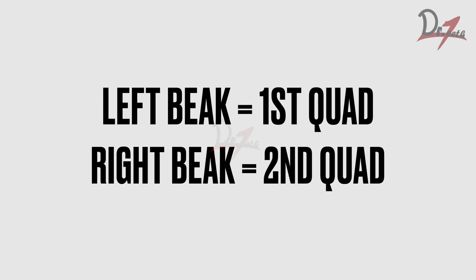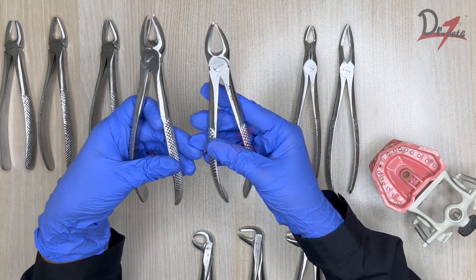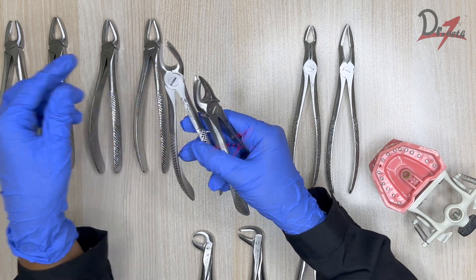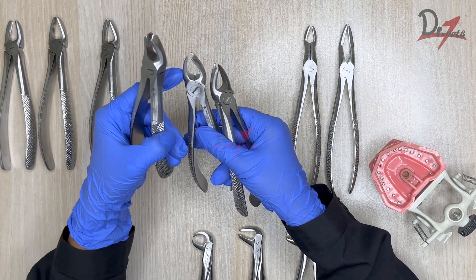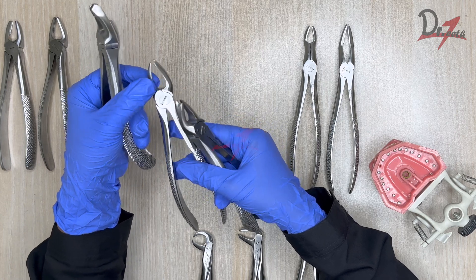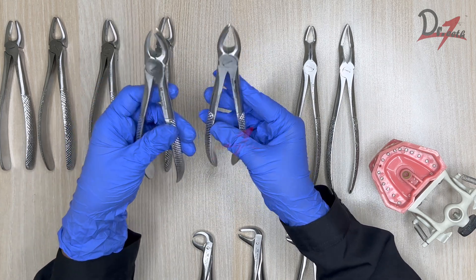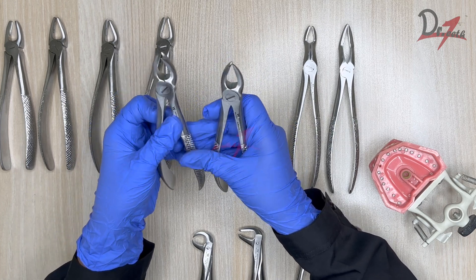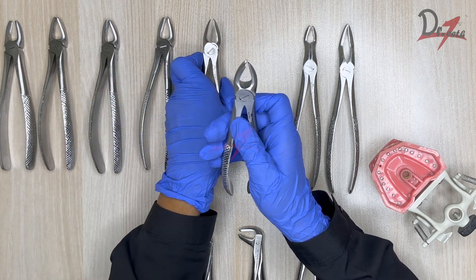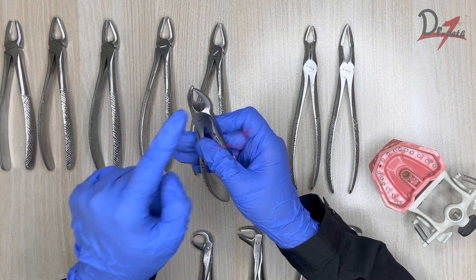These two forceps look very similar to the molar forcep, but these are the maxillary cow horn forceps. Comparing them, you'll notice there is more convexity, it is more pointed and very sharp — resembling a cow horn. So you can make out the difference between the maxillary molar and the cow horn forcep. We also have two types of cow horns: one will be engaged between the two buccal roots for the first quadrant, and the other engages the buccal root on the other side for the second quadrant.